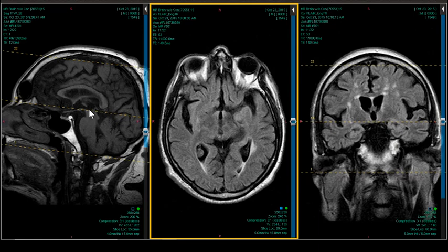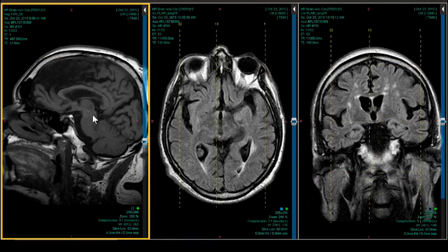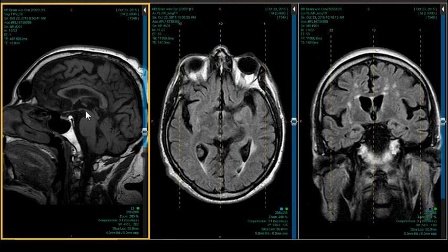So the next thing we're looking at is the midbrain. Now this midbrain looks a little bit different than the last midbrain we saw, that kind of chubby thing. This one's a little bit beaked right here. Okay? See how flattened that is? Sort of looks like a bird, like a hummingbird. And the top of the head, the collicular plate or the kind of crest there, is also kind of a little skinny. Okay? So what this patient had is progressive supranuclear palsy.